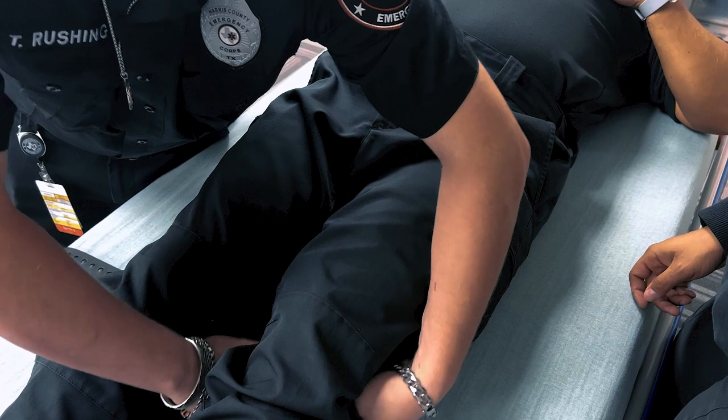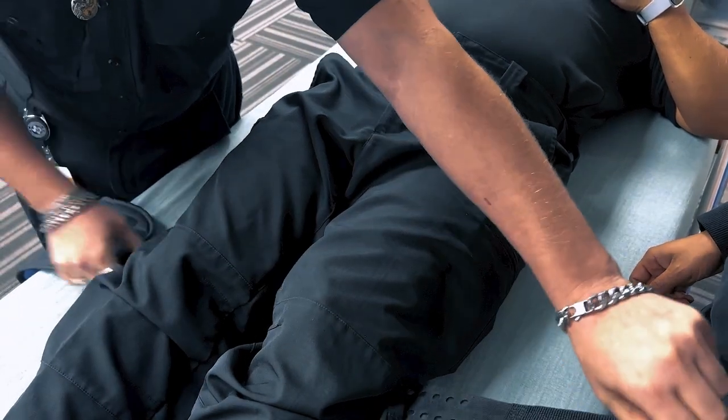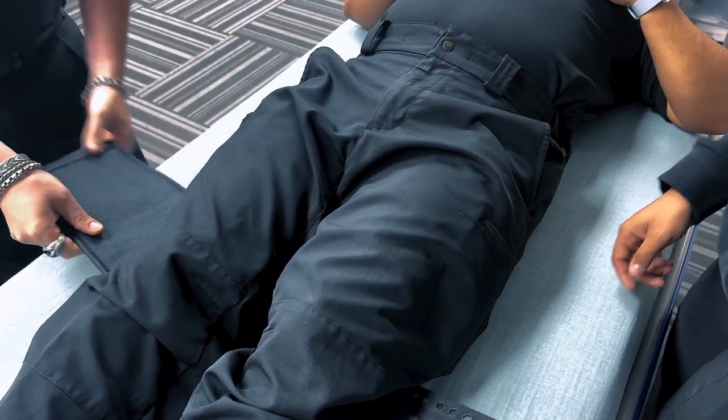Ensure that the binder is not too tight or too loose, as it needs to provide enough pressure to stabilize the pelvis without causing discomfort or restricting breathing.